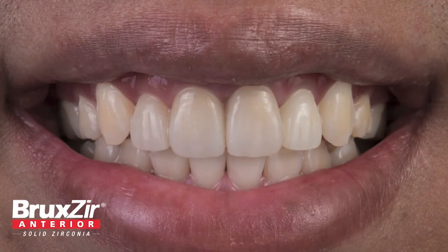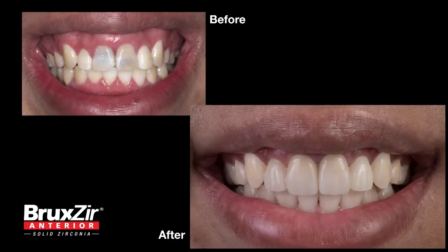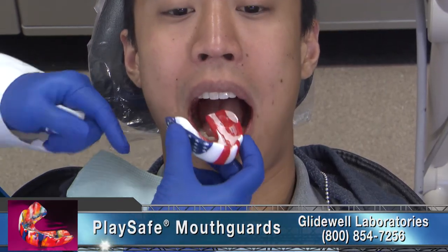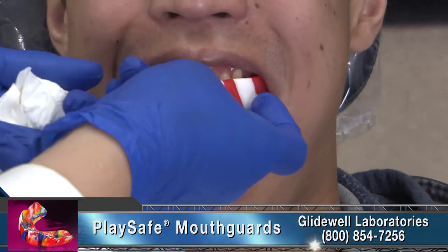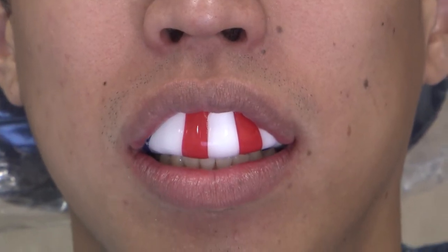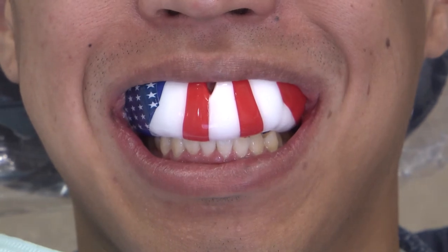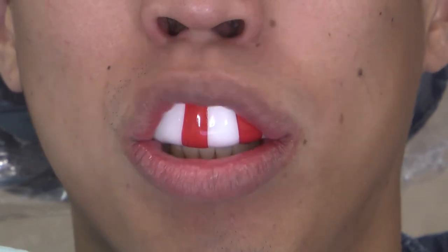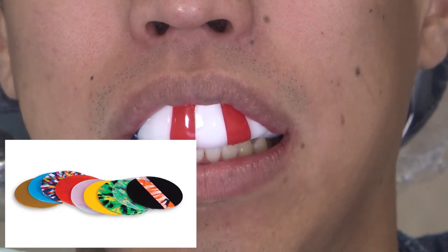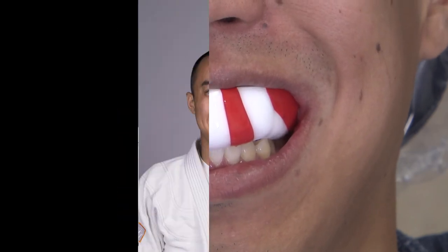These Bruxer anterior restorations are a great choice due to their chip-proof durability, making them ideal for this patient who had broken his natural teeth prior. These new crowns have high flexural strength, a natural appearance, and the ability to withstand his active and high-impact lifestyle. To prevent this young martial artist from future dental trauma, I prescribed him a play-safe mouth guard. Because it has unique power-dispersion bands, it was specially designed for his martial arts needs. This type of play-safe mouth guard can be specially designed with different layers of materials to provide maximum comfort and protection for all sports, with materials available in a variety of colors so you can create your own custom design that will fit the personality of every athlete in your practice.